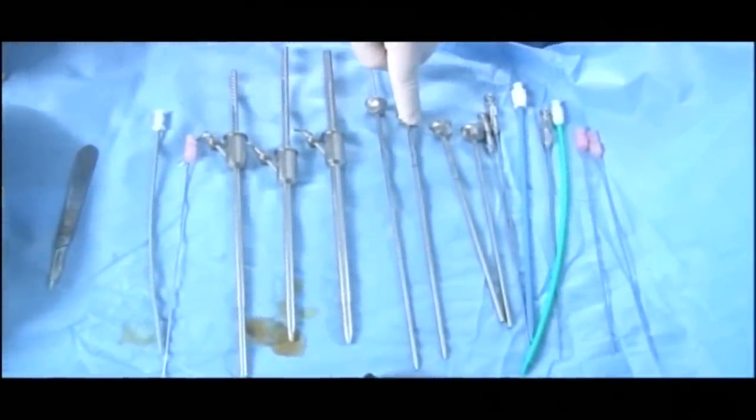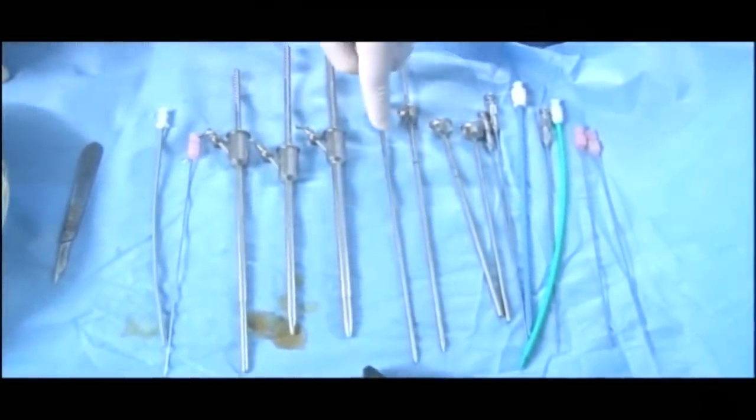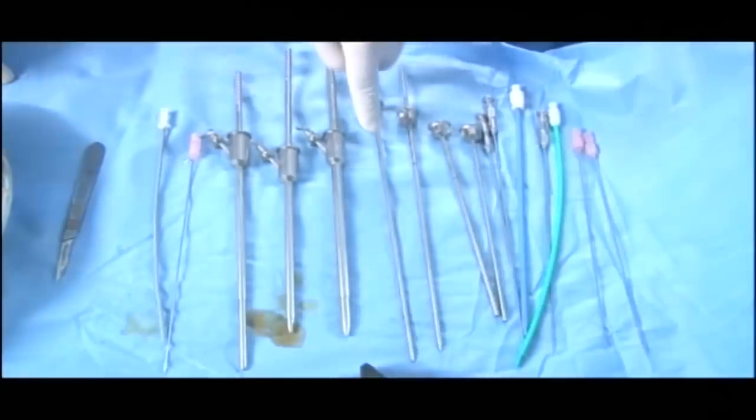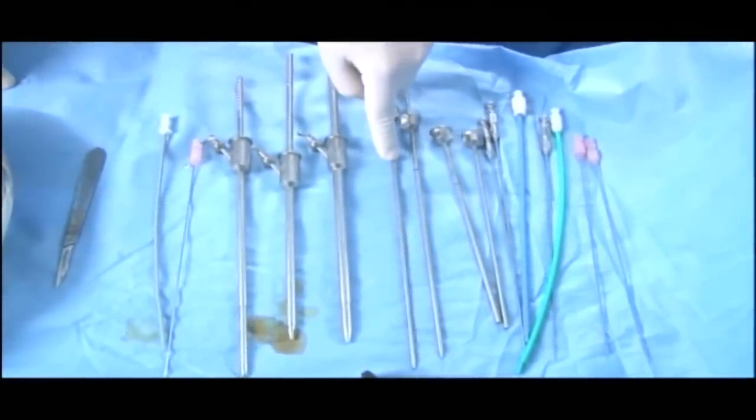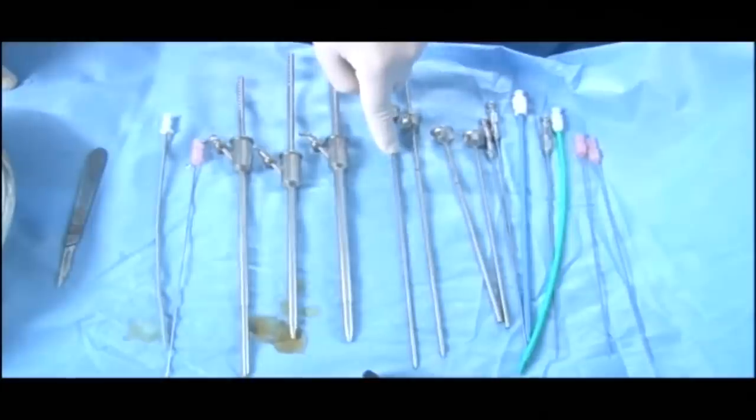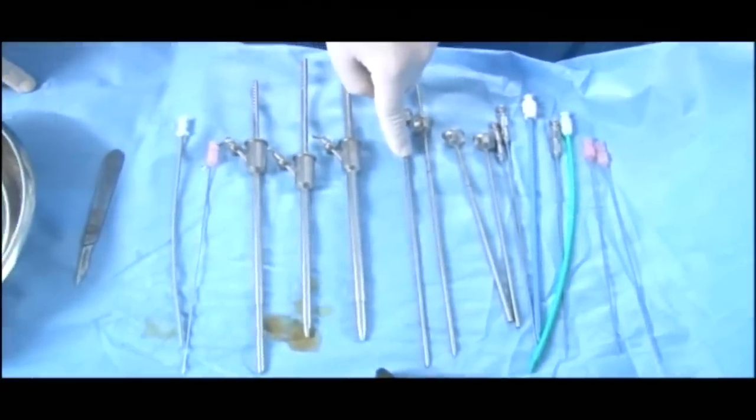This is the 8.5 French by 9.5 French, and this is 11 by 12 French. That is, 11 is the inner diameter and 12 is the external diameter. So that means a maximum of 4 mm — that's all — which is going to traverse the renal parenchyma.